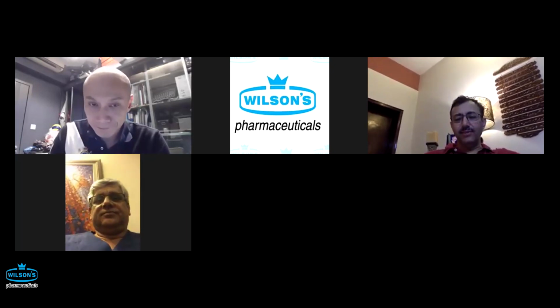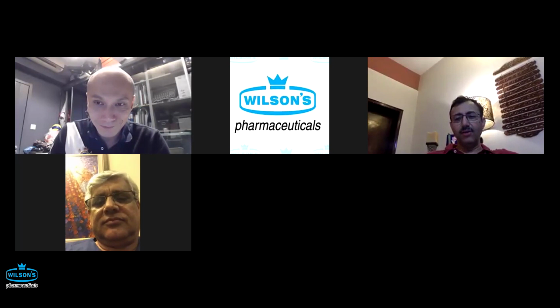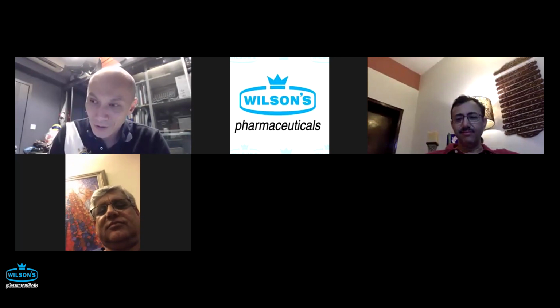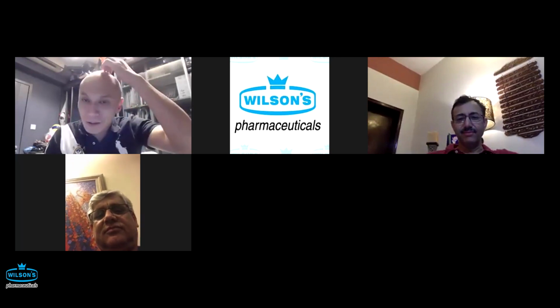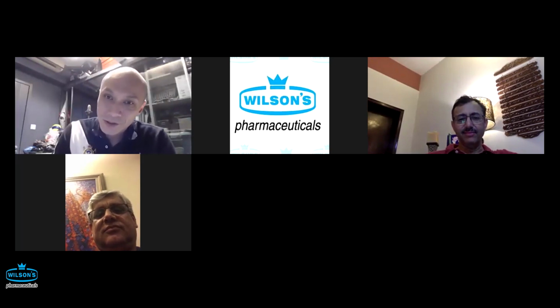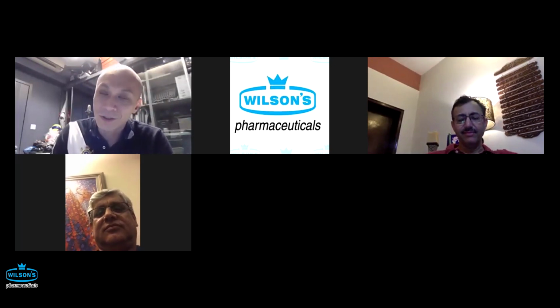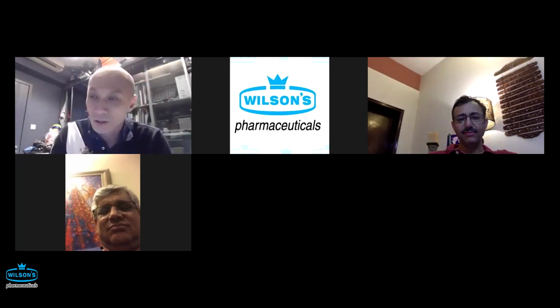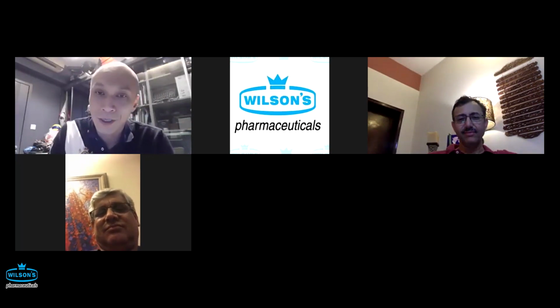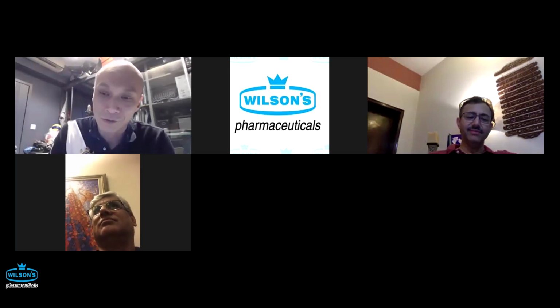And a very interesting question from the audience: how do you define a large stone? What constitutes a large stone? I think a large stone in the literature is defined as anything more than 12 millimeters. In general, for large stones you would need additional devices like mechanical lithotripsy, or even Spyglass or laser, or additional techniques like combined sphincterotomy plus large balloon sphincteroplasty.